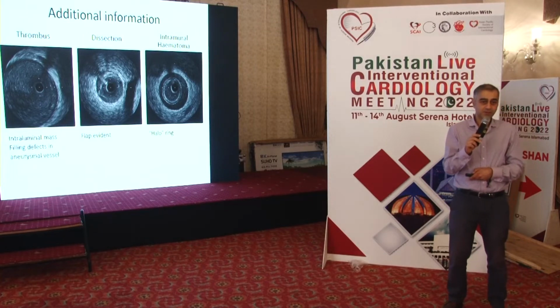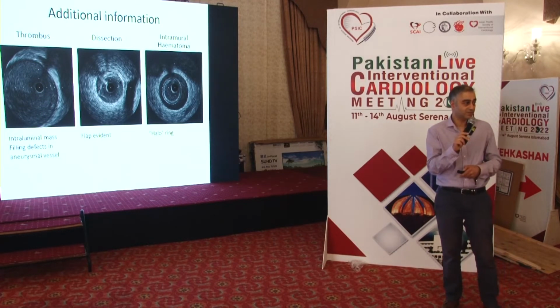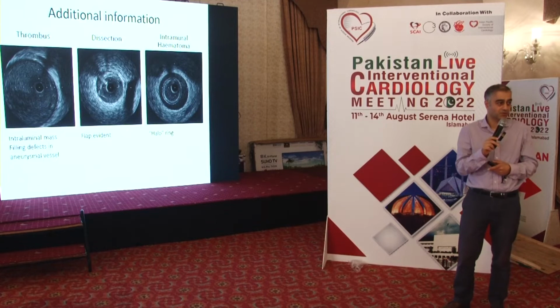Yeah. So the way to do it is just to roughly look at how many of these markers are present. So 1 millimeter, 2, 3, 4, 5, 6, 7. So 7 millimeters probably in diameter. Yeah. So it's a large vessel. It's an aneurysmal vessel. Yeah, because your coronary arteries aren't usually that sort of size.